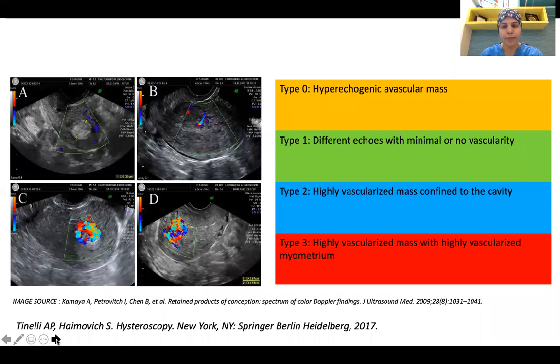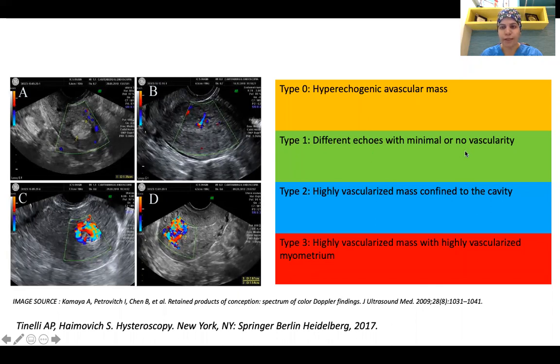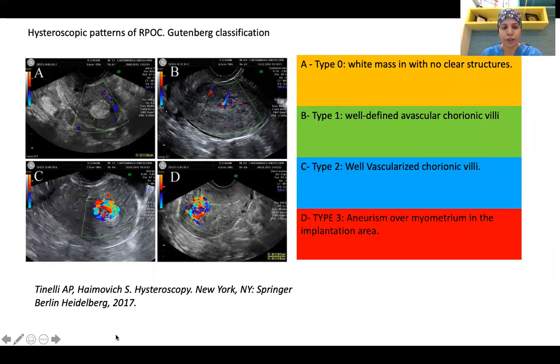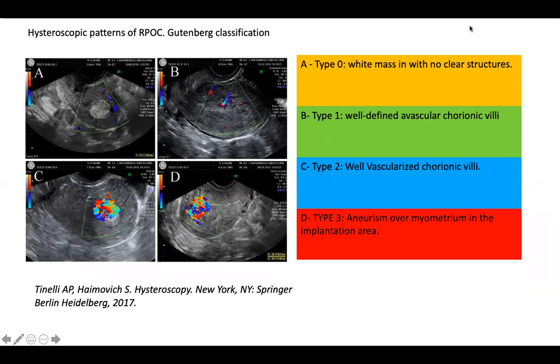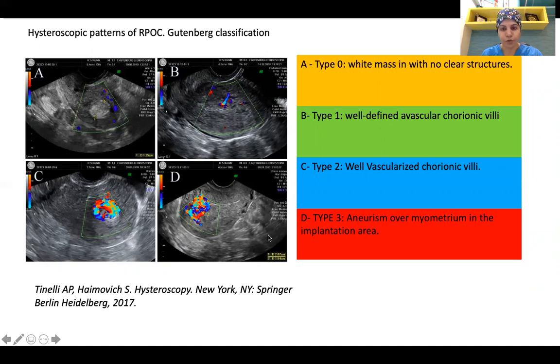If we look at the Gutenberg classification of RPOC, this is an ultrasonographic classification where Type 0 is a hyperechoic avascular mass, Type 1 is different echoes with minimal or no vascularity, Type 2 is a highly vascularized mass confined to the cavity, and Type 3 is a highly vascularized mass with highly vascularized myometrium. When projected to hysteroscopic findings: Type 0 shows a white mass with no clear structures, Type 1 shows well-defined avascular chorionic villi, Type 2 shows well-vascularized chorionic villi, and Type 3 shows an aneurysm over the myometrium in the implantation area, which is sometimes misinterpreted as arteriovenous malformation.